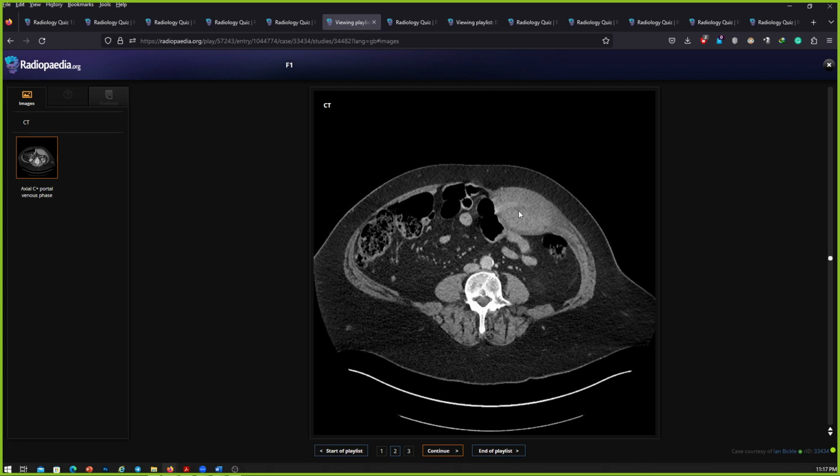Okay, perfect. So I think your time is over. Very well done. You were almost perfect in all the cases. All the diagnoses were reached by you. Just before I give you the feedback and discuss the cases, in this particular case, this is definitely a rectus sheath hematoma. What 3 histories would you ask the clinician or the patient in this particular case?